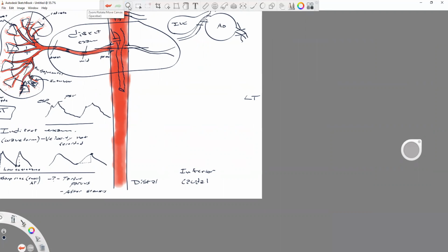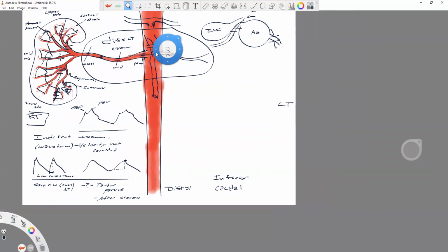Well, here's the thing. For most of my career, I'd look at the kidneys, I'd measure them, I'd look for masses, hydronephrosis, stones. That's what you're doing, by the way, when you're scanning back and forth through a kidney, looking for anything unusual. And then I would throw Doppler on the kidney, and I would say, oh, look, it filled up beautifully. It must be normal.